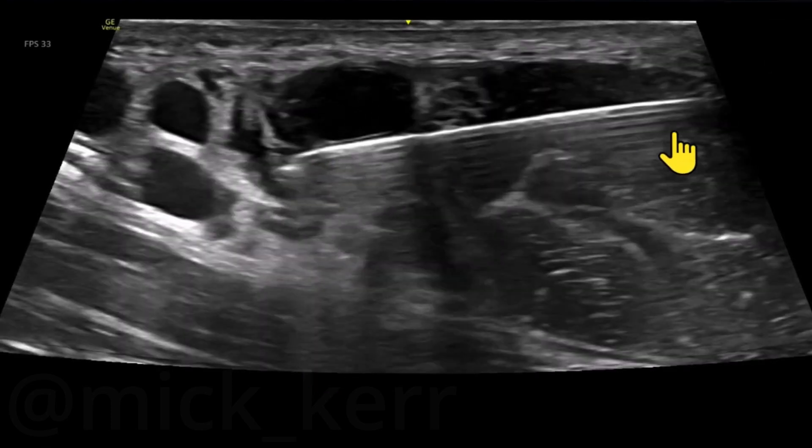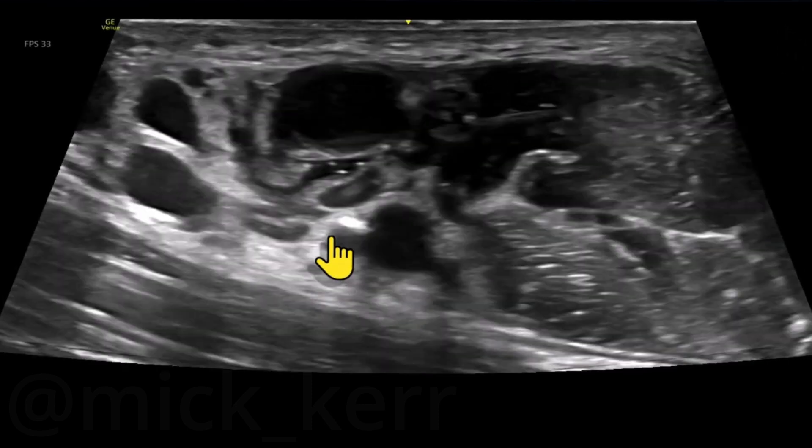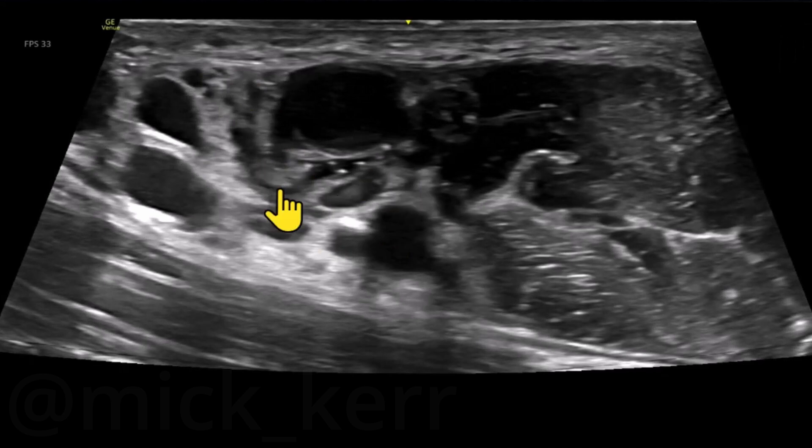You can see the amount of artifact caused by the needle here, so quite often I'll be flicking off — like I've done here — to see what the local spread is like. This is one of those times where if you've always got your needle in view, you're not going to be able to see what's under it.